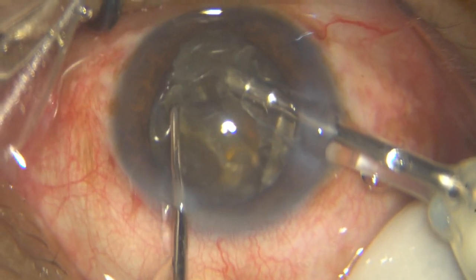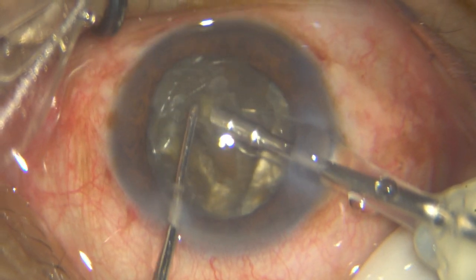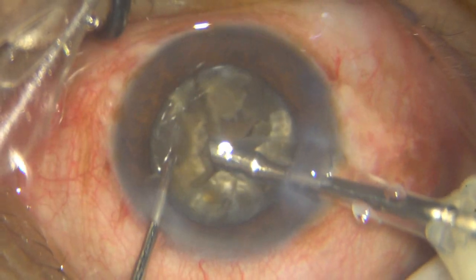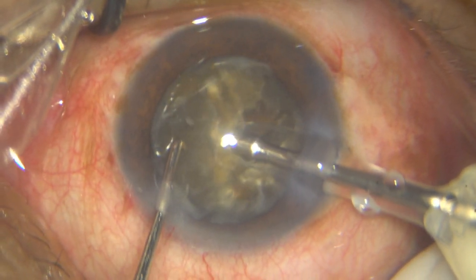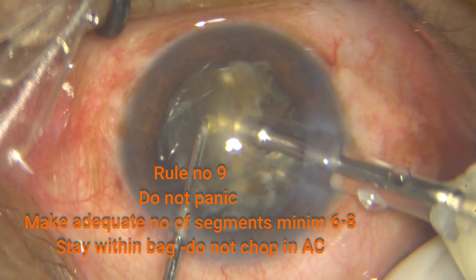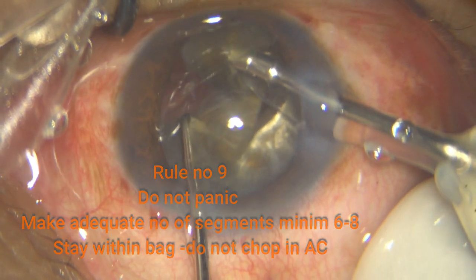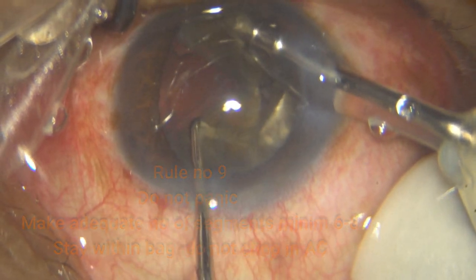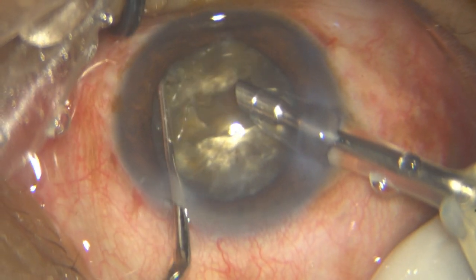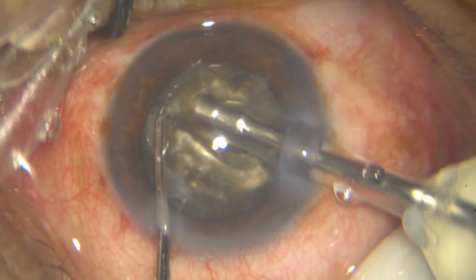And here I am making more and more chops. Look at me. I am going at multi-levels, trying to separate those. Look at those strands that are holding the pieces together. But there is only so much lateral separation that you can do. Try to go deep again. Do not panic. That's rule number 9 and the most important rule. And you have to make adequate number of segments. Minimum 6, if not 8. And keep separating. Do not panic.